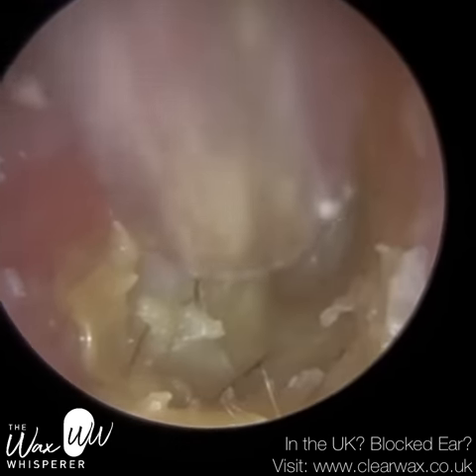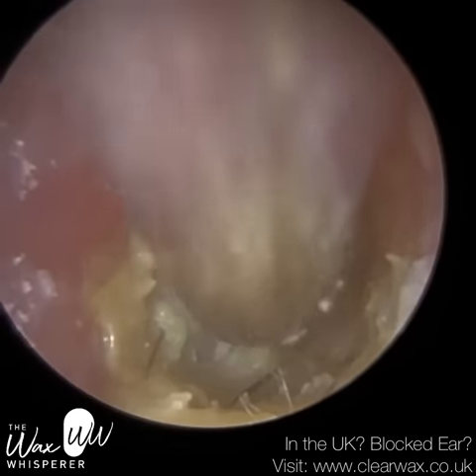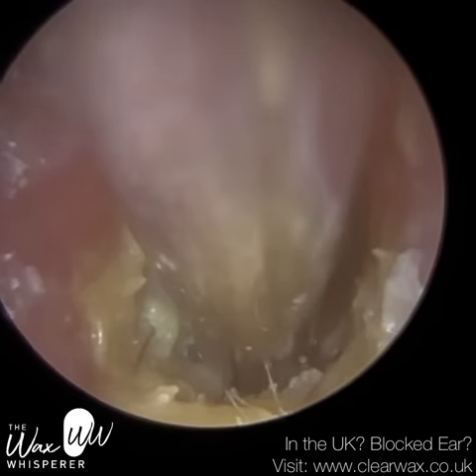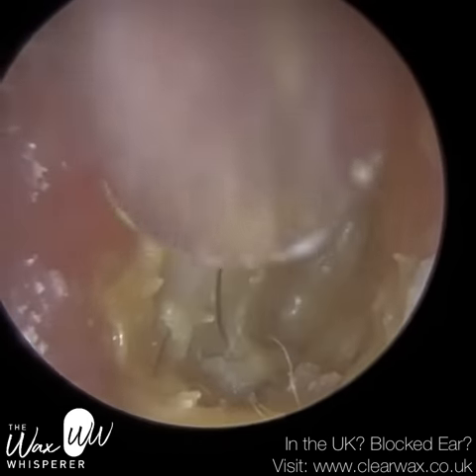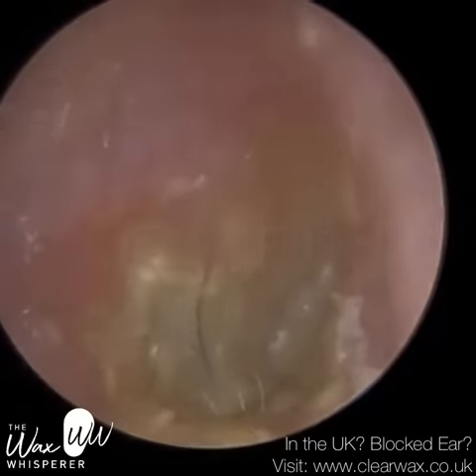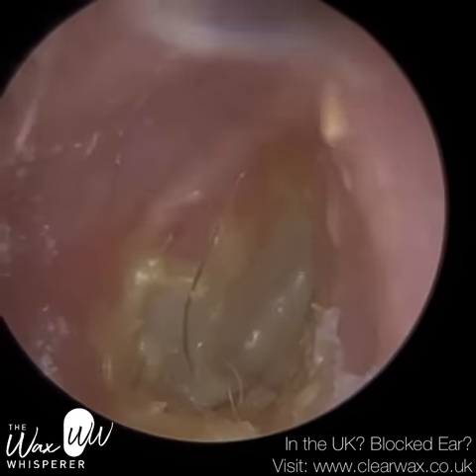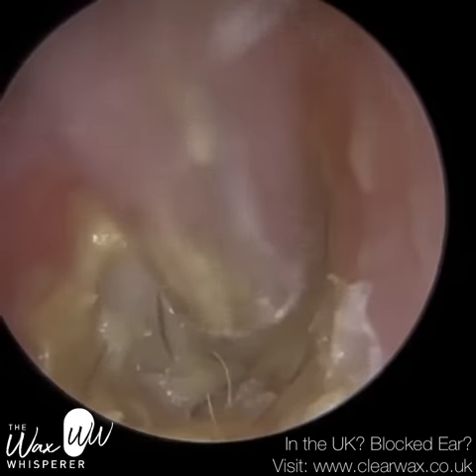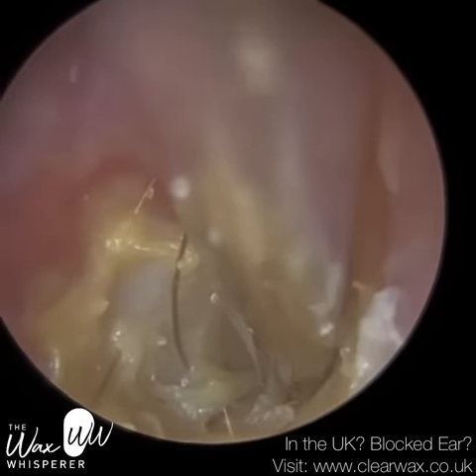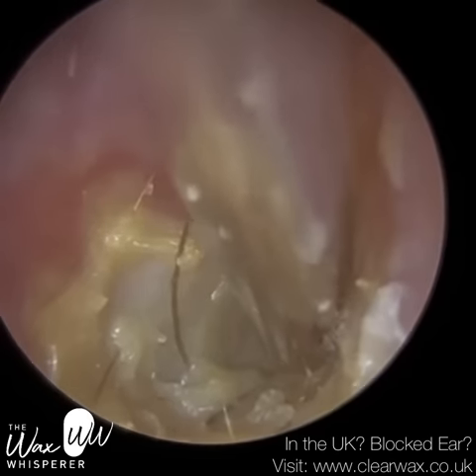In the last four to six weeks I've seen a massive uptick in the number of ear infections coming to the clinic. In fact, I think I'm doing more ear infections than earwax removals at the moment. I'm not sure how the view is if you're watching this — you could argue it's earwax because a lot of it was. I don't know if people enjoy watching ear infection videos — I know some people do, but it'll be interesting to see.